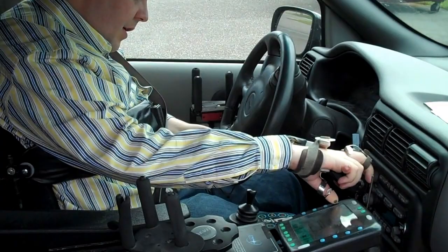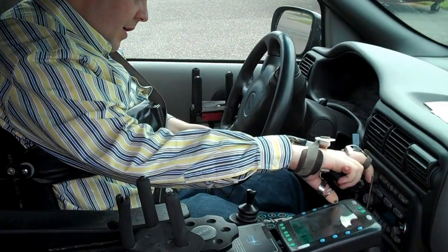On here, on the touchpad, I can control ignition and shifting, starting the engine, and then with this little steering wheel, when I turn this, that turns the regular steering wheel. So that's how I drive.